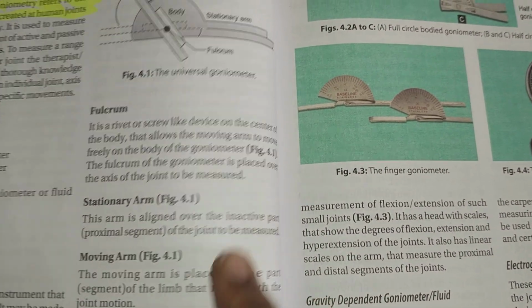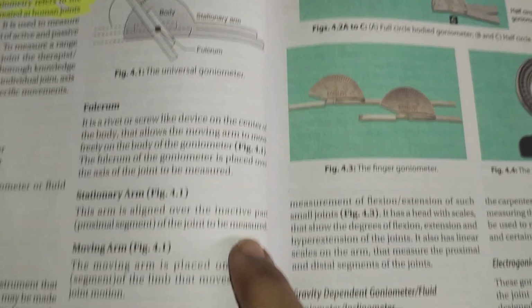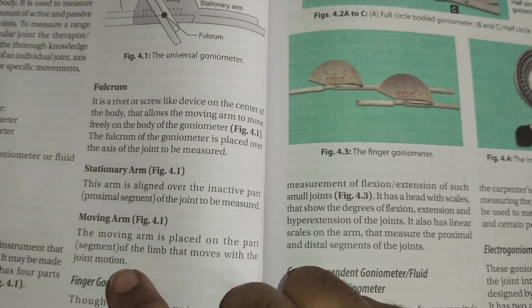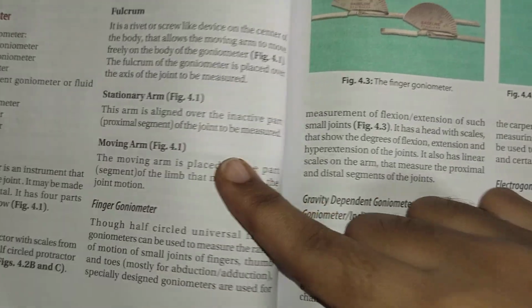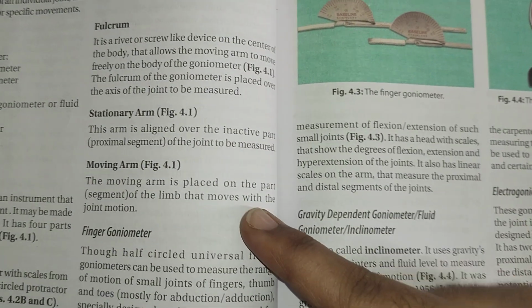The arm is aligned over the inactive part, meaning the proximal segment of the joint. The moving arm is the segment of the limb that moves with the joint motion. The moving arm is placed on the part of the limb that moves with the joint motion.